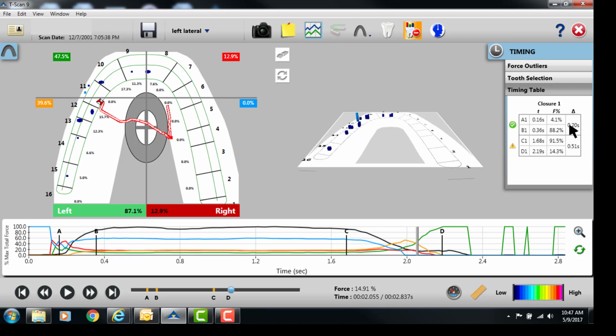At this time, it's 0.20 seconds, and you'll get a green check mark saying that's a good standard to be within. It will turn red if it's above what some of the research that we use recommends. It'll have an exclamation point if it's on the edge of that. So for example here, originally we had a stop sign, and you can go back in the video and look at that real quick, but you can see that it's an exclamation point, meaning that we've improved but we're still on the border. Ideally we would want this D line, you can see as I move it, to move closer to the C line, and you can see the check mark pops up.